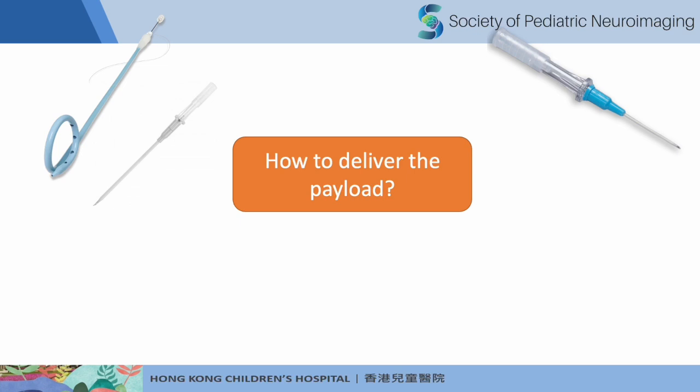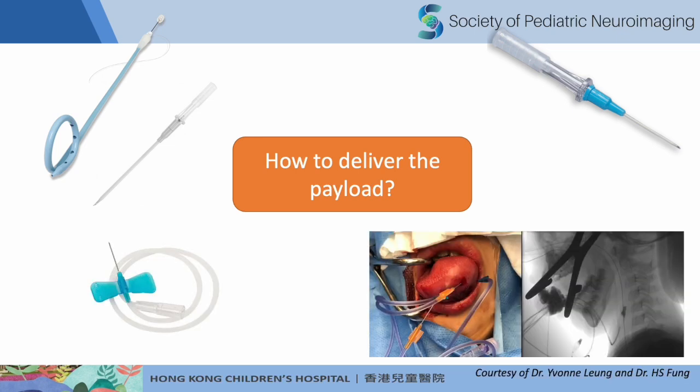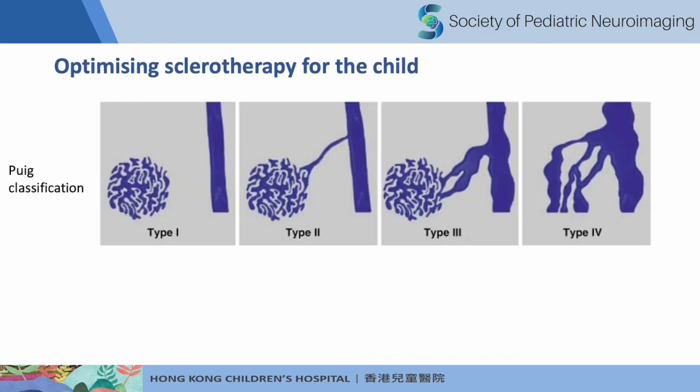And for VMs or LMs, you can also use a 22-gauge angiocatheter. Just make sure you use adhesive on the extension to make sure that stays in place. You can also use a butterfly needle. But again, the most important thing is you need the needles to stay in place during the sclerotherapy, especially between the venogram or the lymphogram and injection. You don't want the needle to come out so that you extravasate into the surrounding regions.